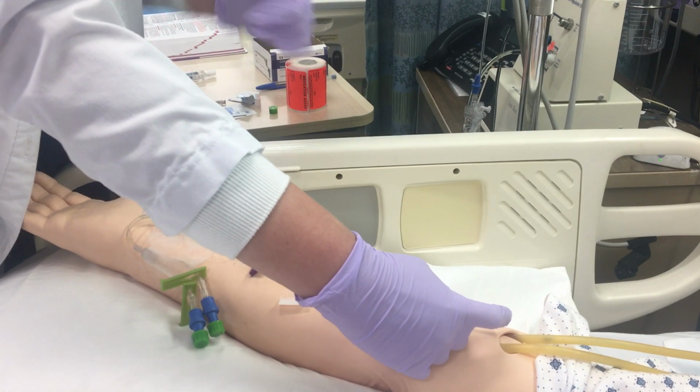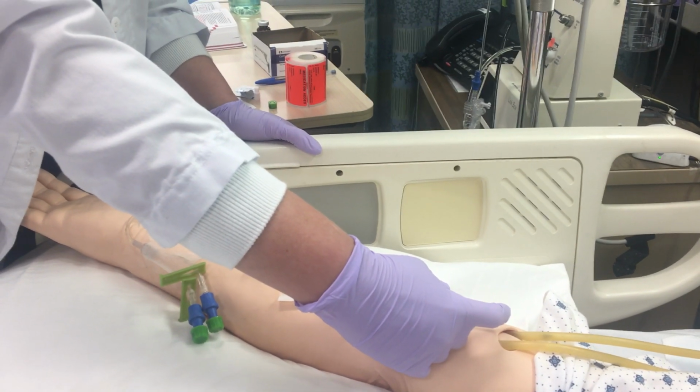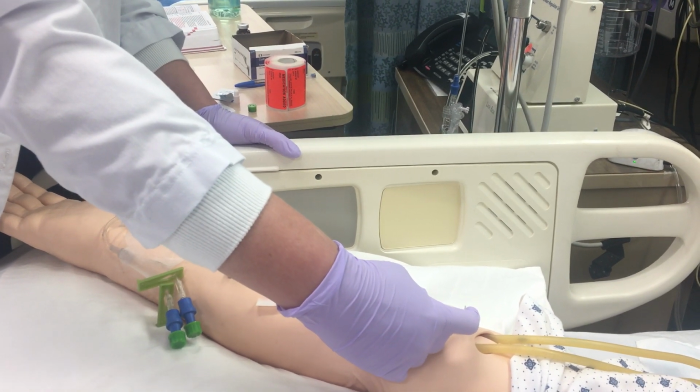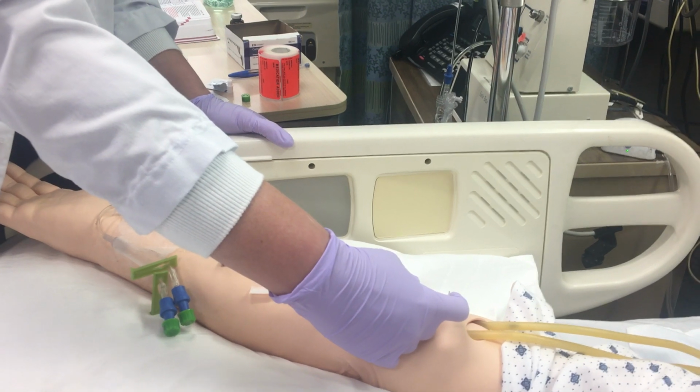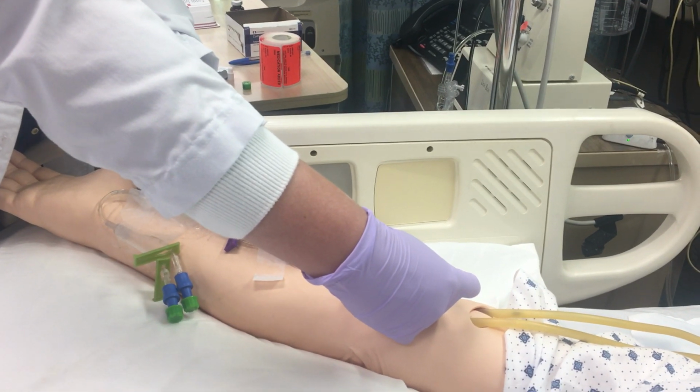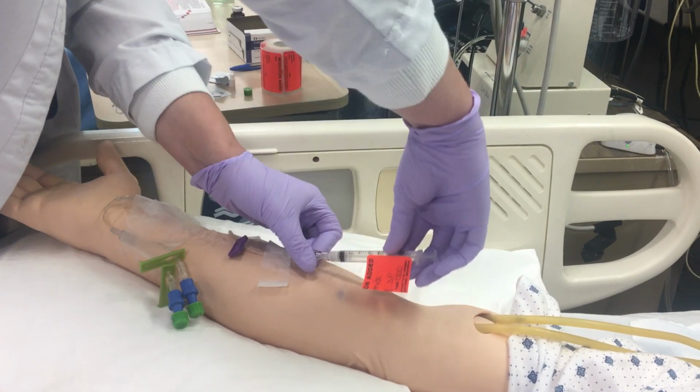You should have a watch for this, and in clinical you should be prepared and have a watch and be watching that administration of the IV push medication. For the purpose of the video, I'm going to go a little bit quicker.